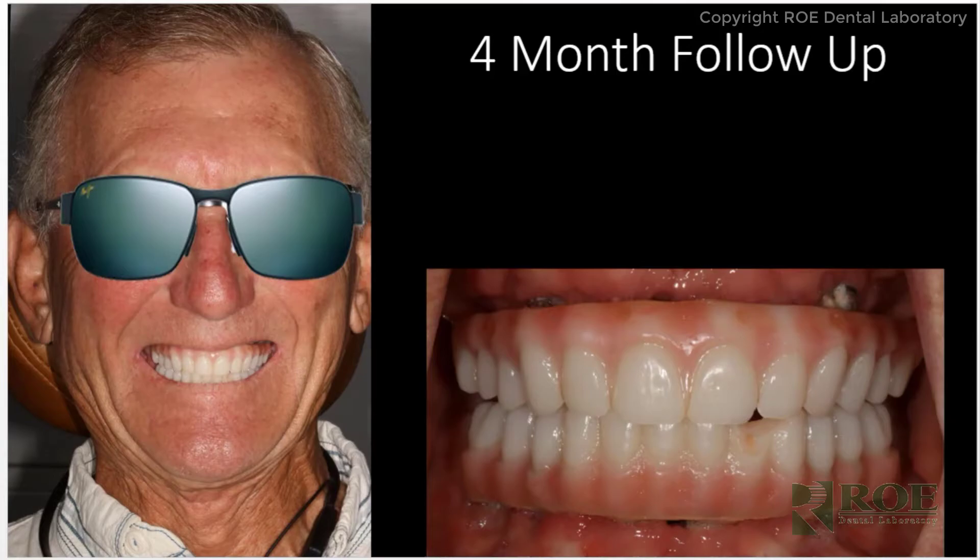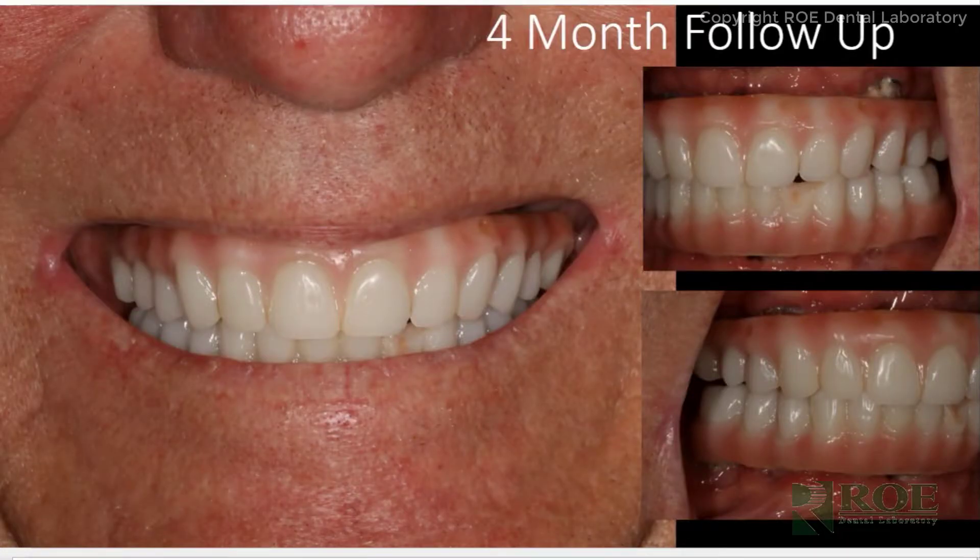Some healing caps were placed, sutured, and the prosthetic was delivered. That was the surgical protocol for the upper and lower. This is a delayed case — many cases involve upper and lower in the same day, but this one was delayed by patient choice. In the follow-up, there needed to be some aesthetic changes. The case was going fine — implants all integrated, nice solid prosthetic — however, a little bit of a gummy smile, which will be fixed during the restorative phase.